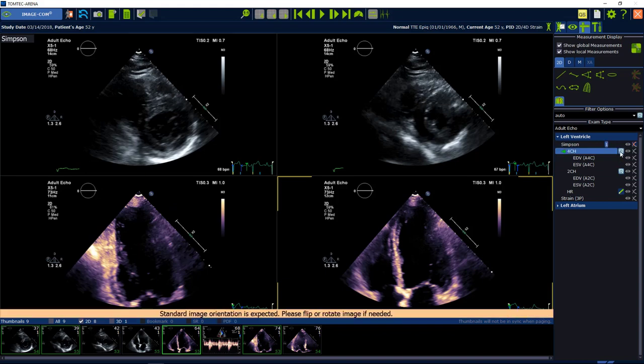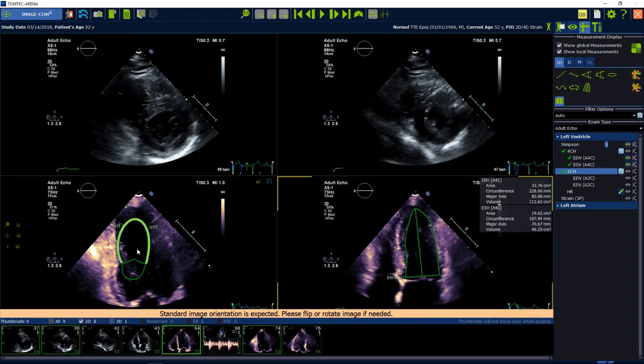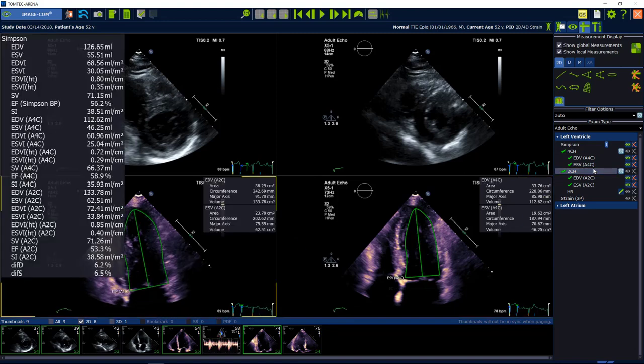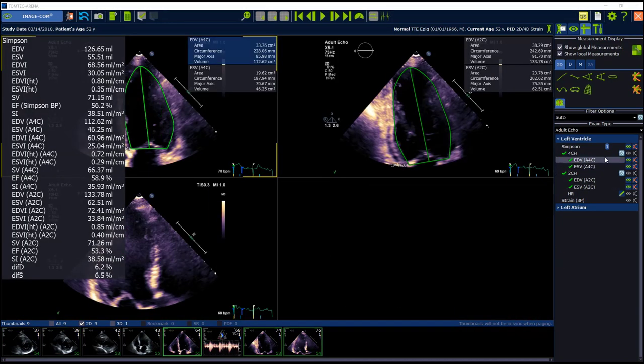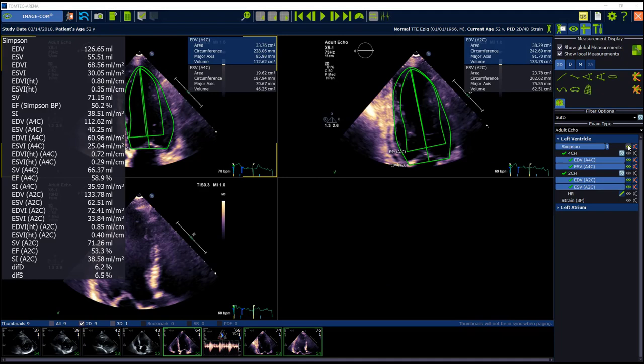Click on the icon on the right. Confirm the view, four-chamber and two-chamber view. Wait for the results.